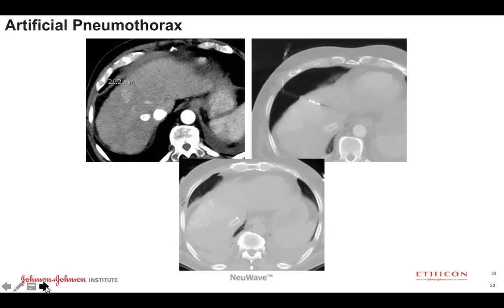Once they're under anesthesia or sedation and their tidal volumes go down, that liver just goes right up into the diaphragm, right up into the chest, and before you know it, there's lung everywhere you look, unless you take a really steep subcostal angle.